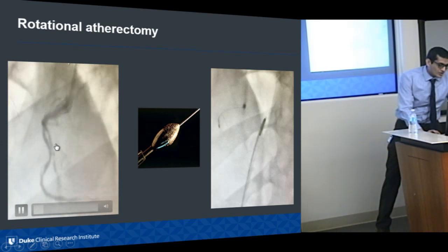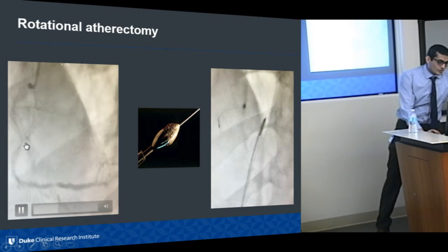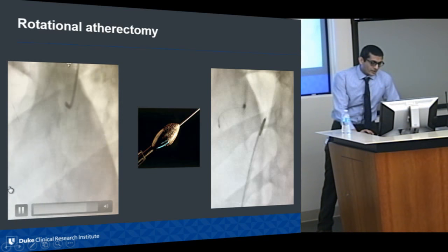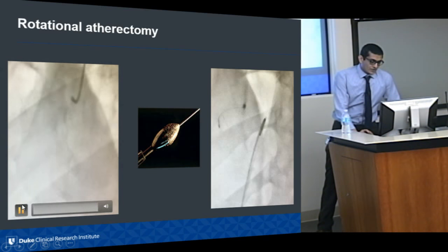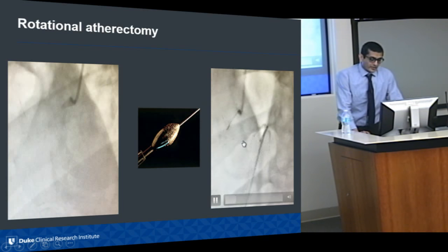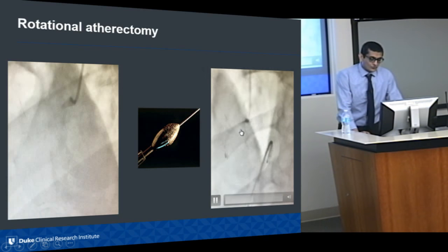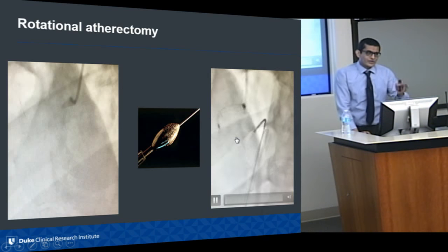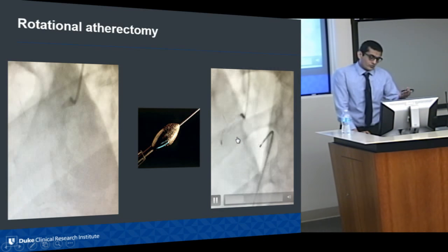And so this is an angiogram where we were really having trouble dilating one of the spots here in the middle. And so essentially used a drill bit like this. It has all these diamond studs that essentially chisel out the calcium. And you just basically peck through until it finally goes through there. And that essentially just creates a path for balloons to go through.